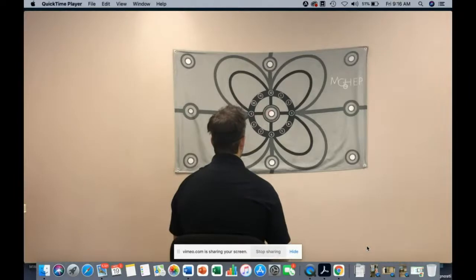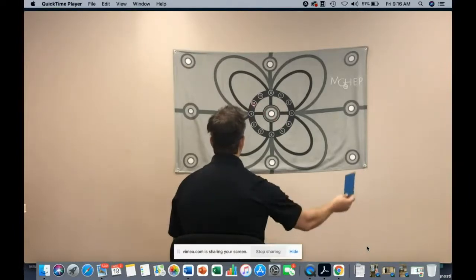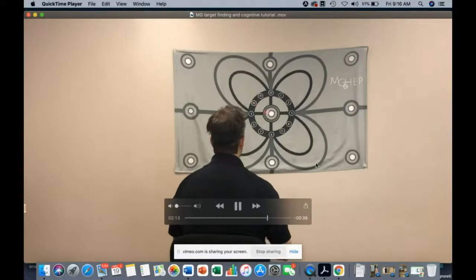You can also do some peripheral vision training on recognition of different colors. Those could be for go, no-go responses, and see what the responses are there. Some more frontal lobe type of integrations there.